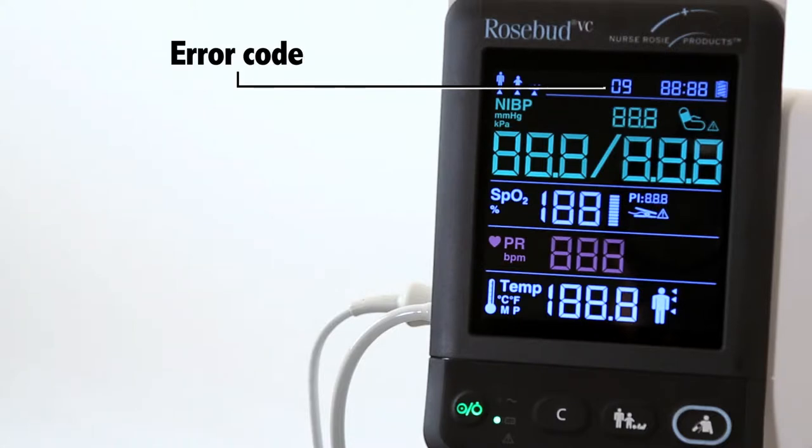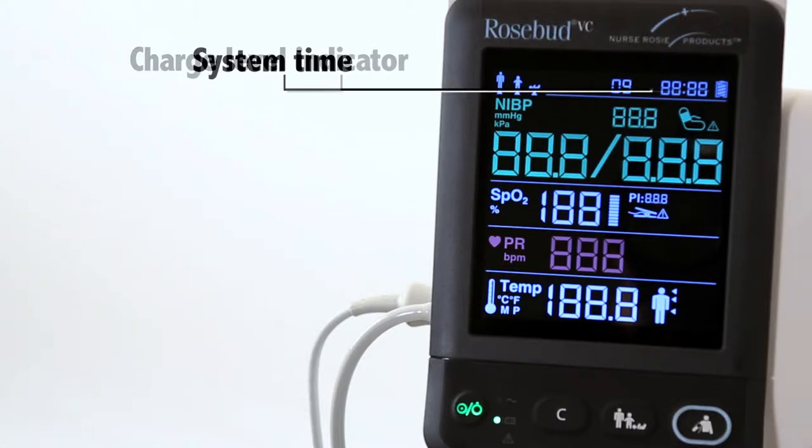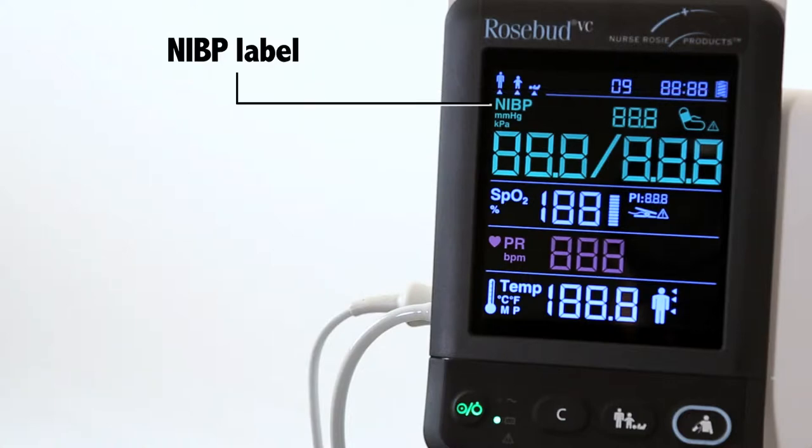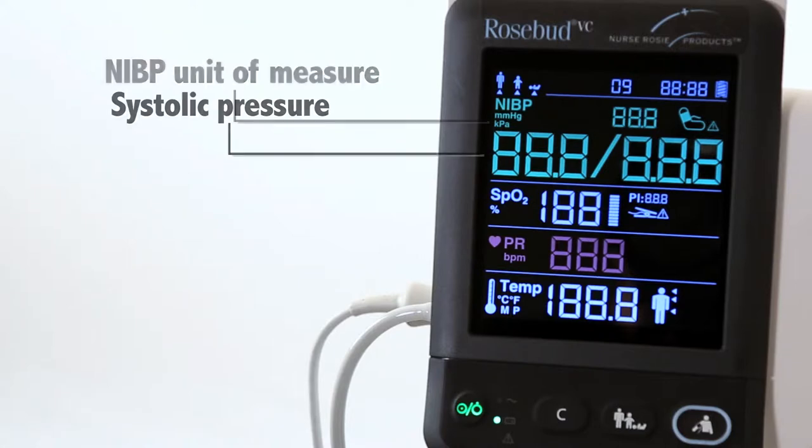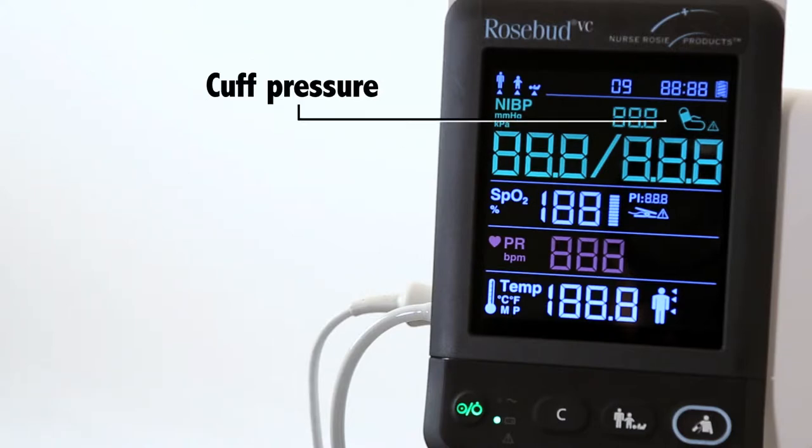The display also shows error code, system time, charge level indicator, NIBP label, NIBP unit of measure, systolic pressure, cuff pressure displayed during NIBP measurement.